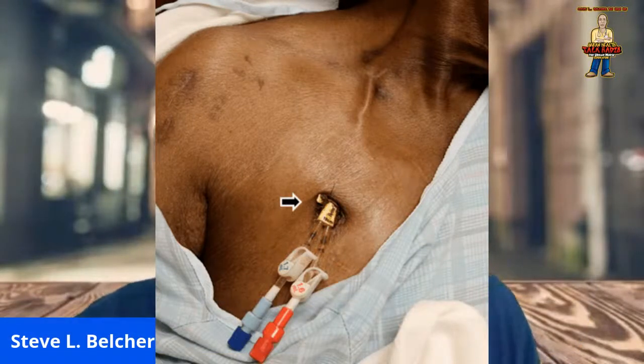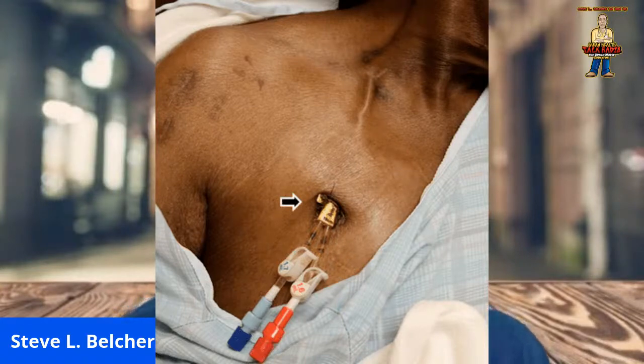Now, what happens, and you've got to think about this because this has happened to a lot of warriors. What happens when my catheter is not working well? A lot of warriors don't know if their catheter is not working well because the technician may not tell them that. A decrease in the blood flow rate ordered by your doctor is a sign the catheter is not working as it should.